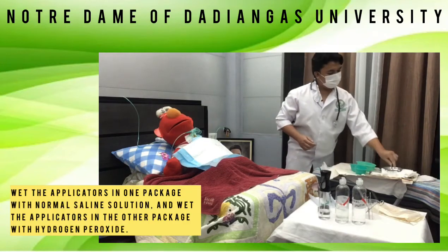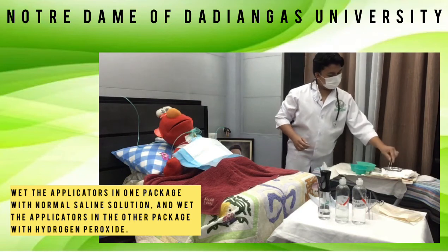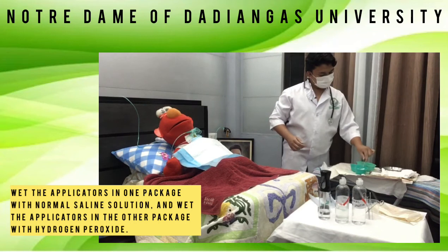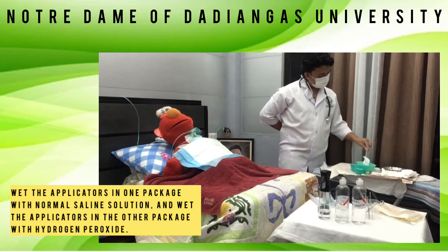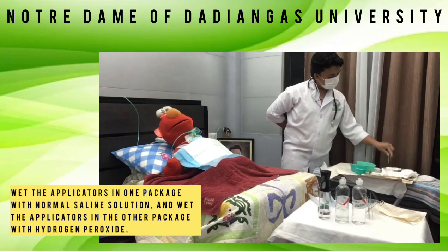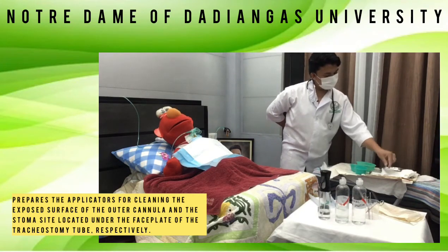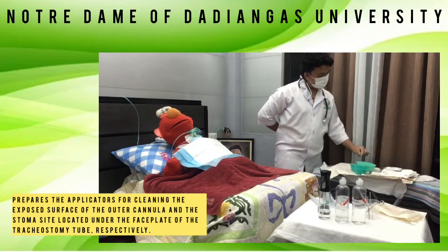Wet applicators in one package with normal saline solution and wet the applicators in the other package with hydrogen peroxide. This prepares the applicators for cleaning the exposed surface of the outer cannula and the stoma site located under the faceplate of the tracheostomy tube, respectively.